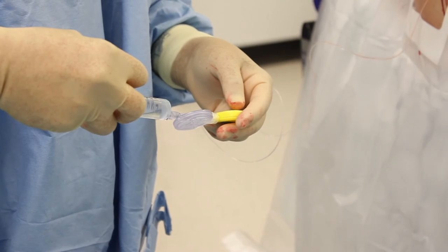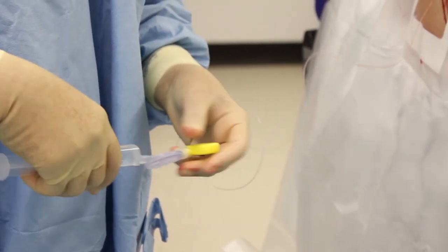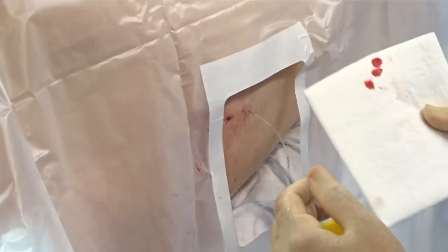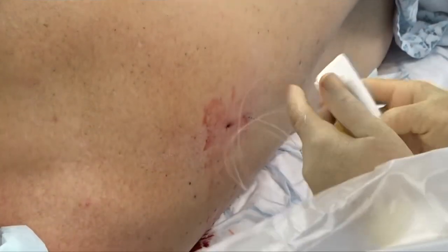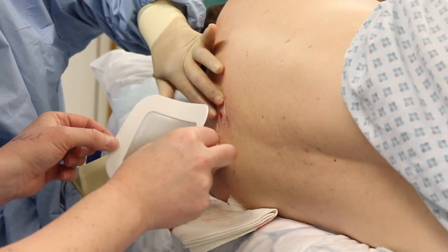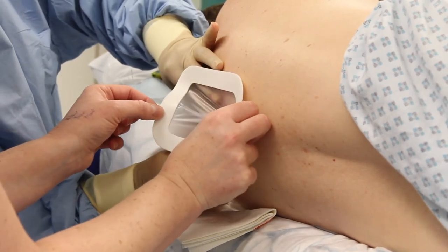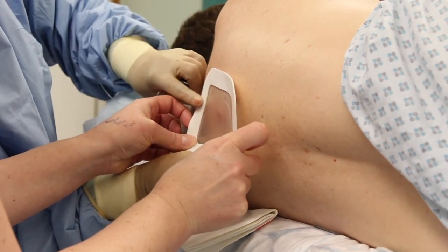We then attach a connector to the end of the epidural catheter and flush with local anesthetic to ensure the catheter is correctly secured and located within the epidural space. After removing the sterile drape, we create two loops of the catheter around the entry site before securing the epidural catheter to the patient's back with a transparent adhesive dressing.